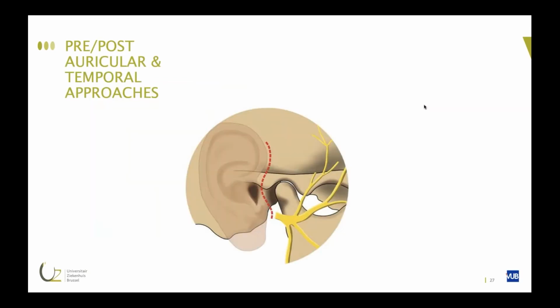You may use a pretragal incision or a retrotragal incision with a hockey stick extension, a temporal extension, or something in between, which I prefer.